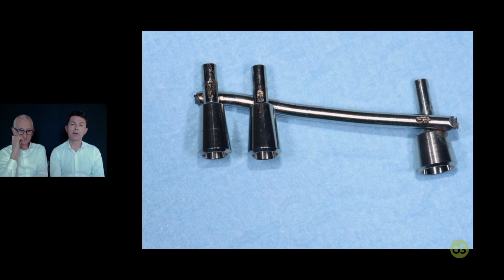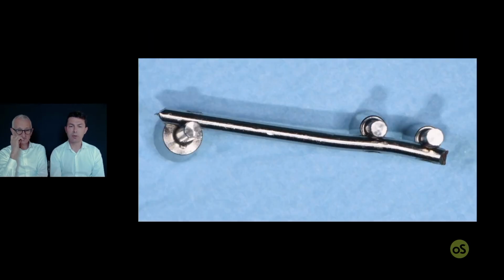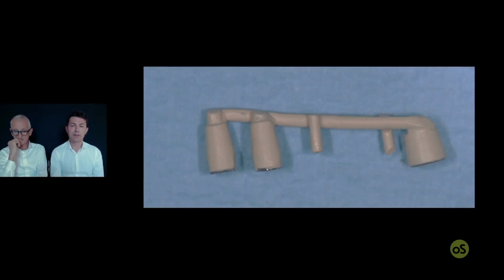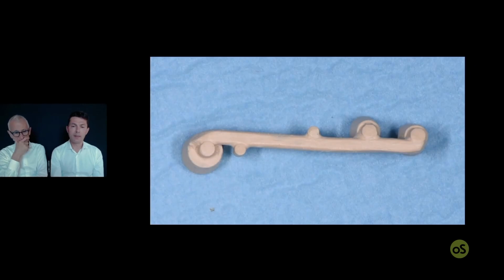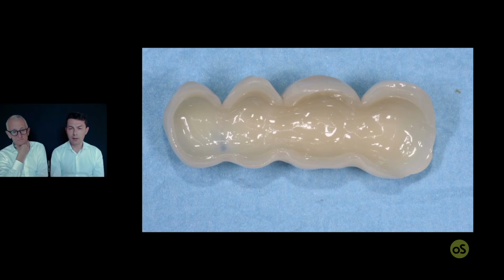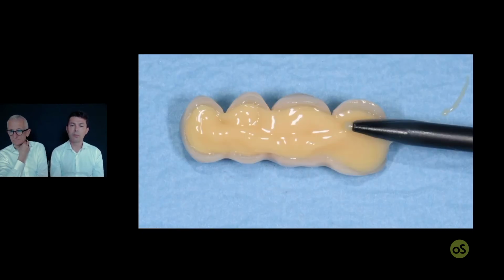And now extraorally it's possible to increase the framework and add some material, some retention, vertical spurs. After, it is important to cut the length of the retention, cover with the opaque, and again in the mouth it's important to realign the two parts, the framework, open the link with the dedicated primer, fill with the composite.